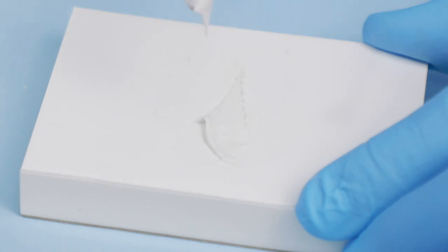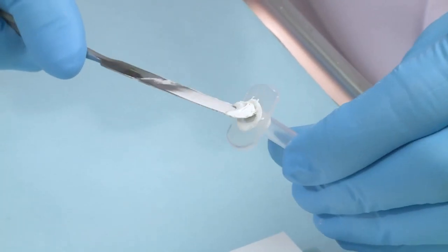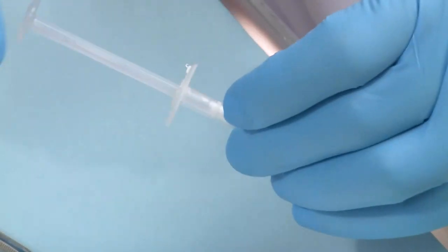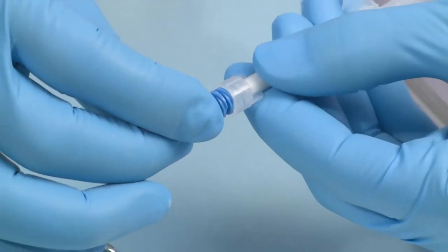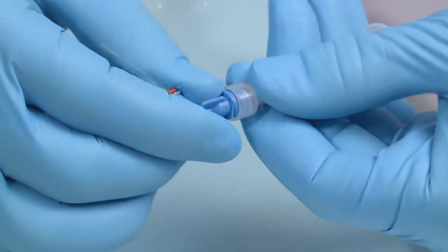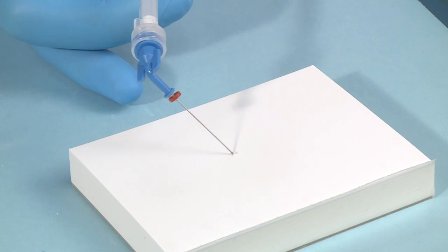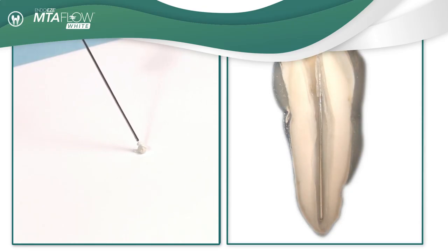Mix to a smooth consistency, insert the mixed MTA Flow into the back of the skinny syringe, reinsert the plunger, and choose the desired tip needed. We suggest the use of the Ultradent NaviTip 29 gauge tip to accurately deliver the MTA Flow inside the canal.